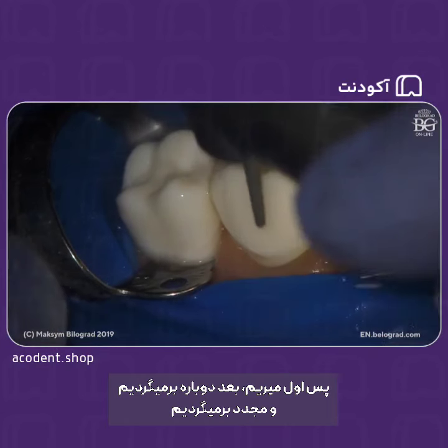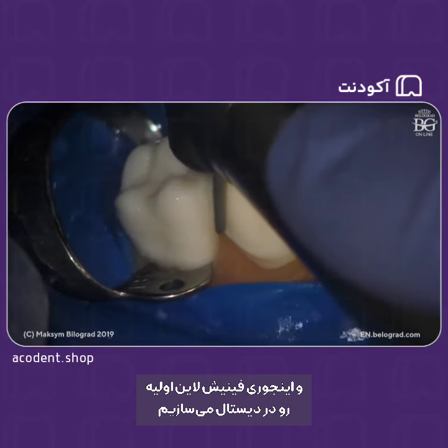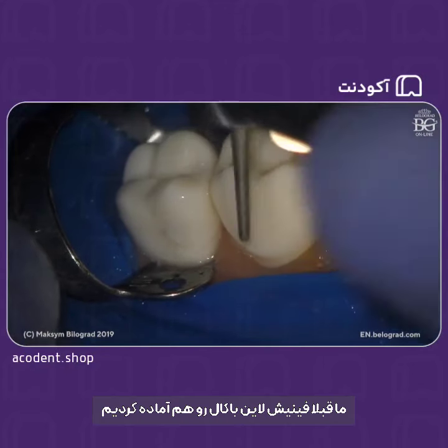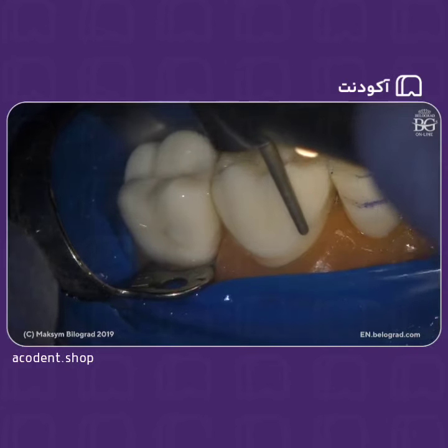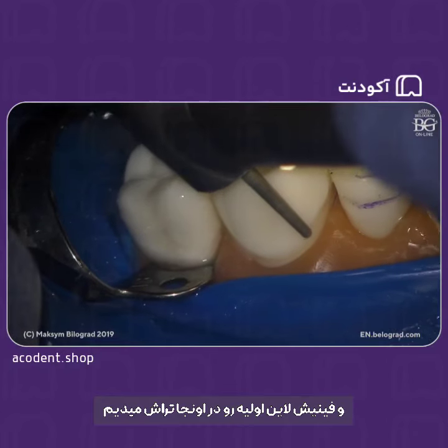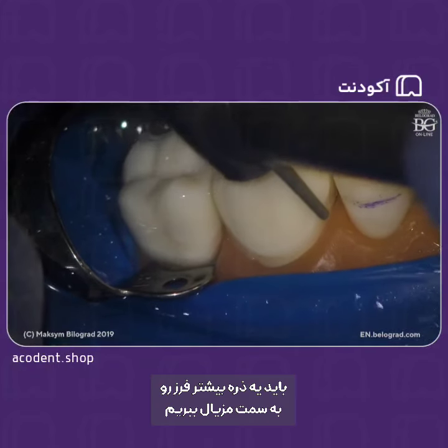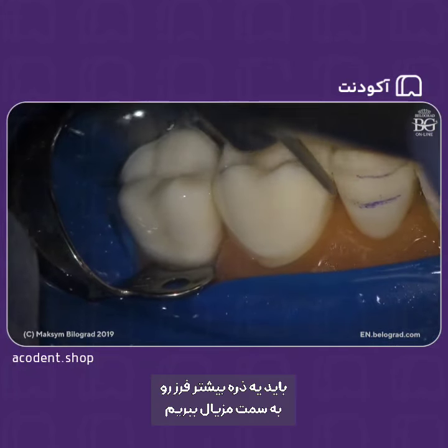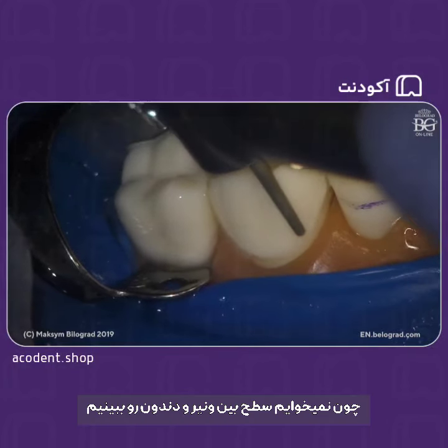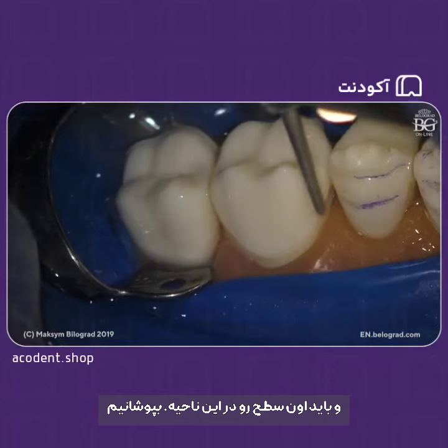So we go, and then we turn, and we make the initial finish line. On distal, we have already made the initial finish line from buccal, and now we move and turn our burr to the mesial aspect of the tooth, making the initial finish line here. And we have to move a little bit more to mesial, because we don't want to see the transition. We would like to mask the transition here.